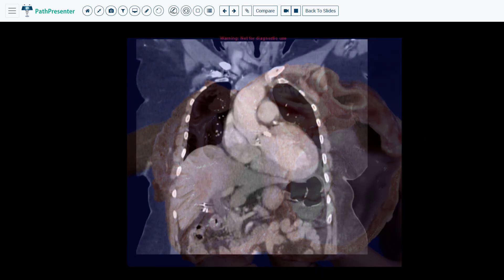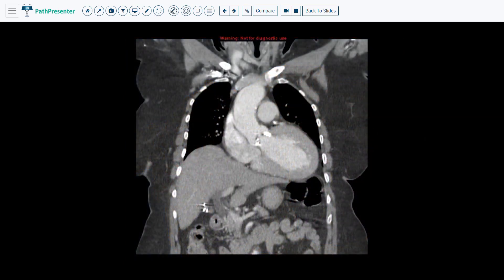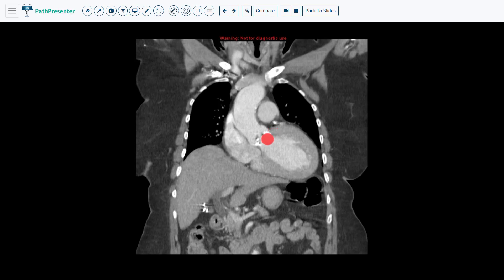Case 1 is calcific aortic valve stenosis. This coronal CT scan shows the thorax and upper abdomen. This is the right lung, this is the left lung, and this is the heart. This area is the left ventricle, and this is the aorta. So in between them, this area is where the aortic valve would be. These white lesions here represent the calcification of the calcific aortic valve stenosis.